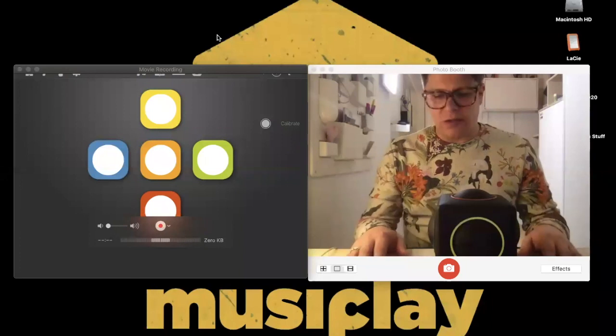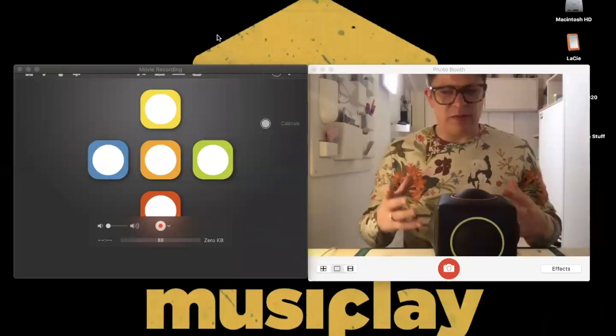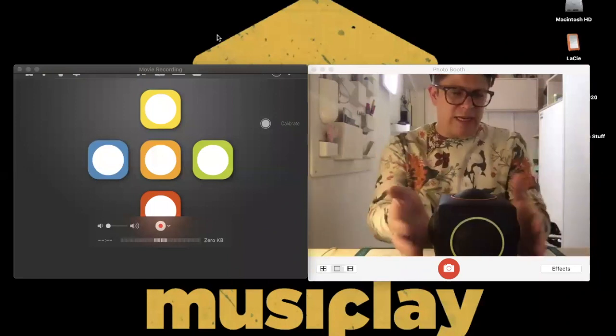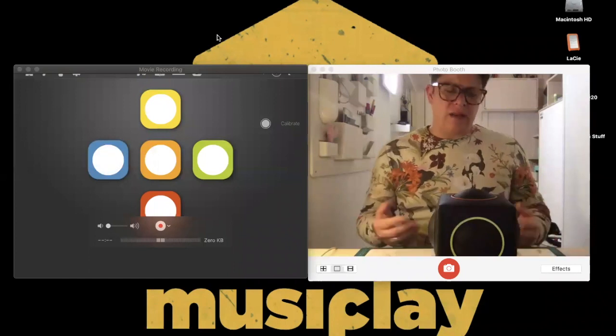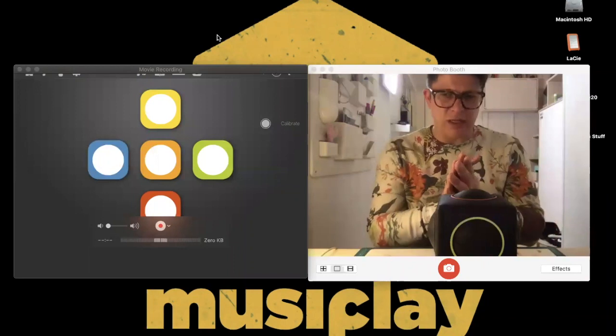So moving on. That's how sensitive it can be, and also you can maximize that sensitivity in terms of how the Skoog is placed in relation to your user. For me, on a desk, that's great, but I'm already someone with limited ability to lift my hands up here and to get midline crossing going on and everything.